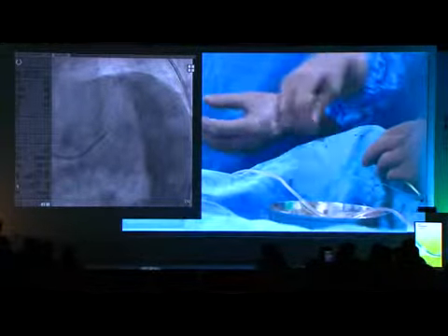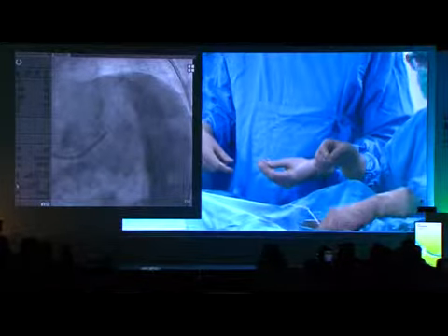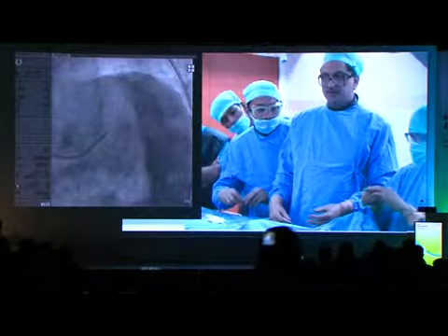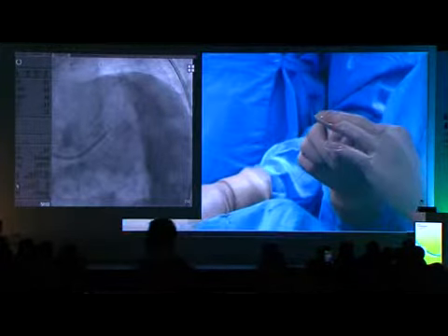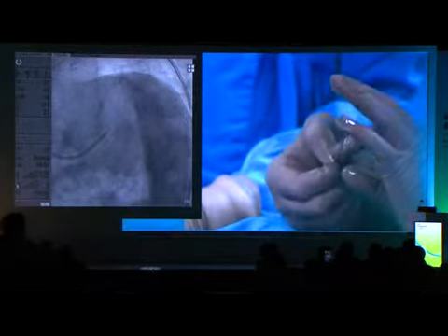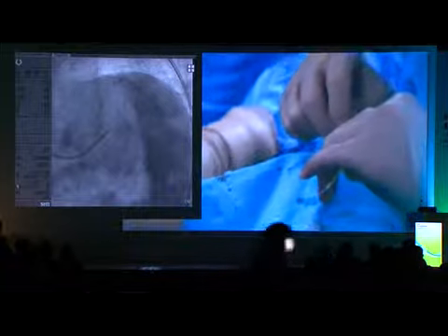I have a question. What was this patient's echo like, the anterior wall? How is the anterior function? The total ejection fraction is around 35%. Well-preserved thickness of the anterior wall, not scarred and thinned out. Okay, so it's of particular interest to try to open.